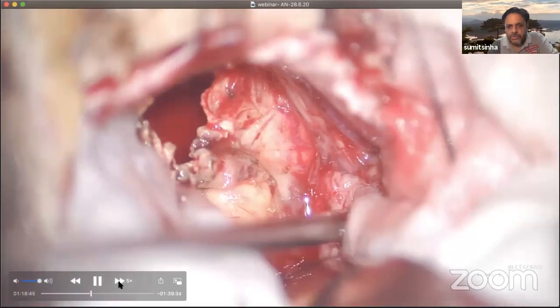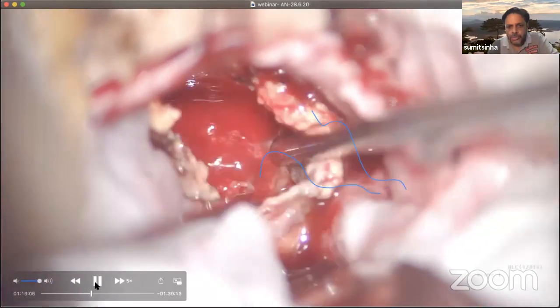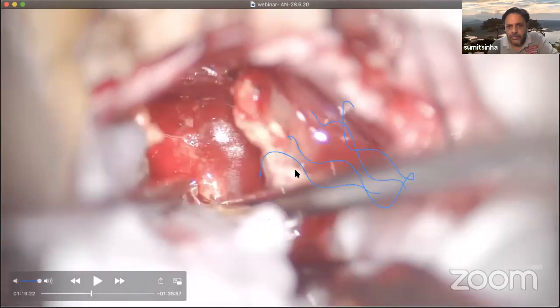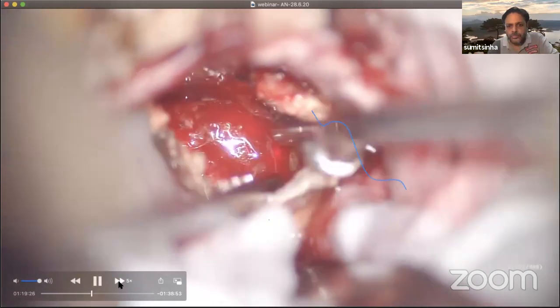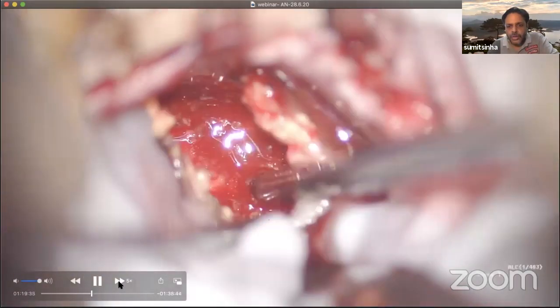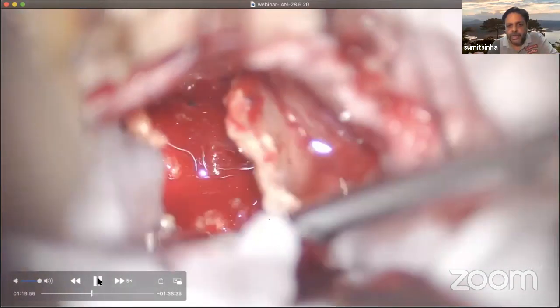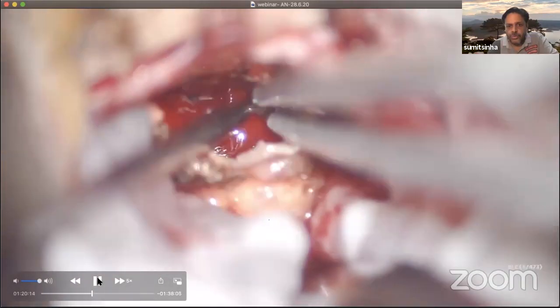Now, coming again to the lower pole of the tumor. Why am I getting these lines on my screen? Now, the purpose of coming again to the lower pole is to find my seventh nerve complex. I have not found it till now, so I'm getting desperate now.